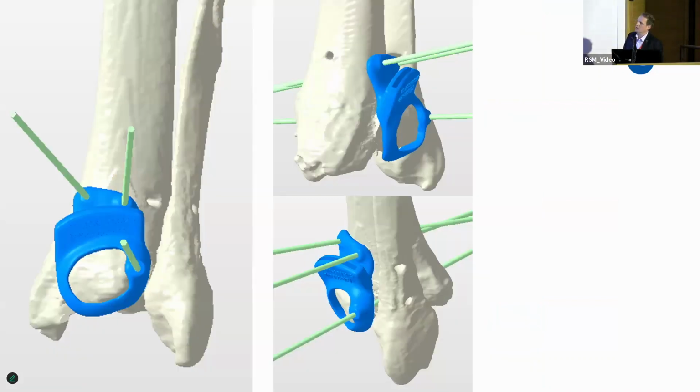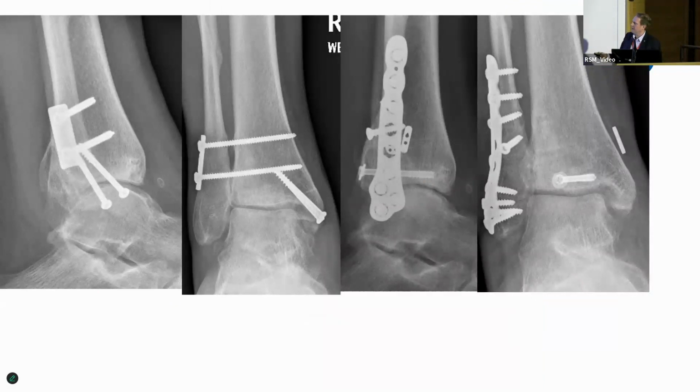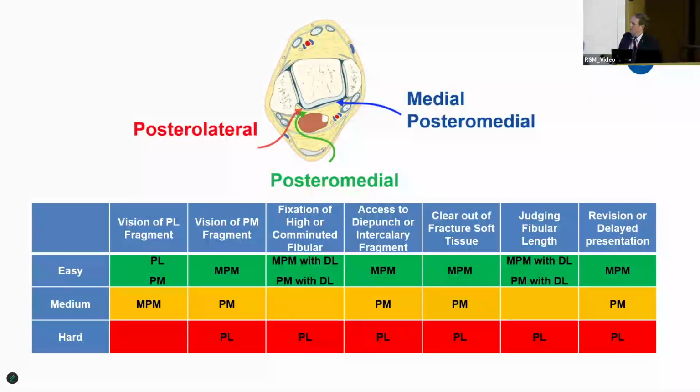Initially, when he went to get a guide to do the osteotomy, this is the guide that was designed. It was actually delivered, but to try and get that and put a saw through there, you essentially had to do your incision as high up as the knee. But when you can come through the MPM here, you can actually get to this. So we actually didn't use the guide at all. I gave him a hand on it to get that back in the right position. It's never great doing these revisions anyway. So as you can see, the posterolateral is not great, but the MPM is great. Okay. So from my perspective, it's the reason why I have changed.